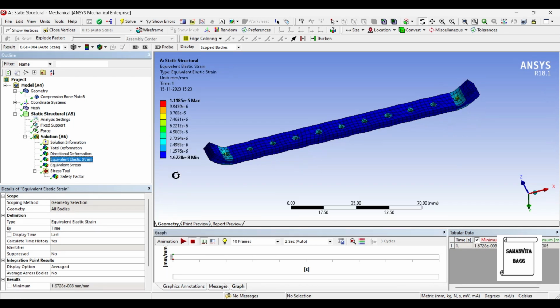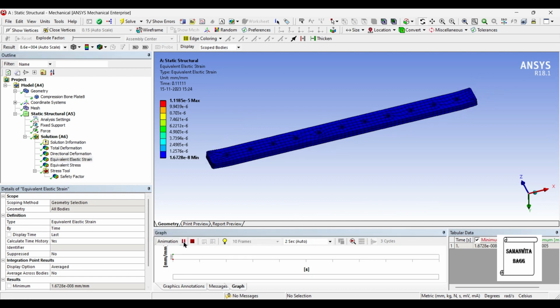Next, we'll go for the equivalent elastic strain. The value of strain is 1.1185 into 10 raised to minus 5. That's the maximum value. Again, it is generated in these zones of the hole and the surrounding area. Also, you can animate and see this result.